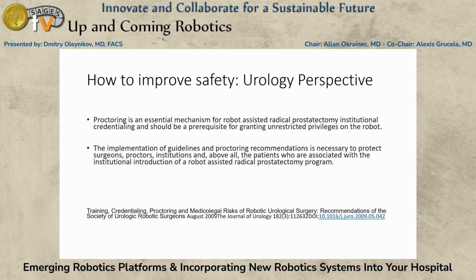So what that means, there should be procedures, and we have a very extensive procedure for surgeons that come and proctor on some of the new technology. For instance, we're doing robotic bronchoscopy now, and so it was a very deliberate process to get that technology in and get those cases done safely.